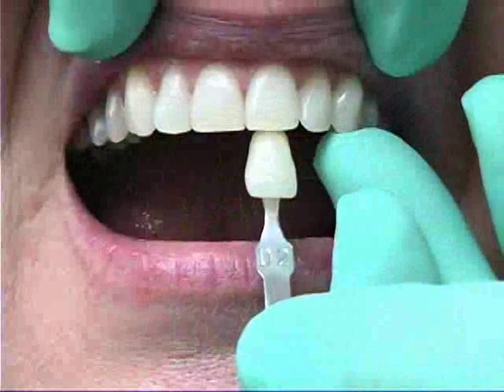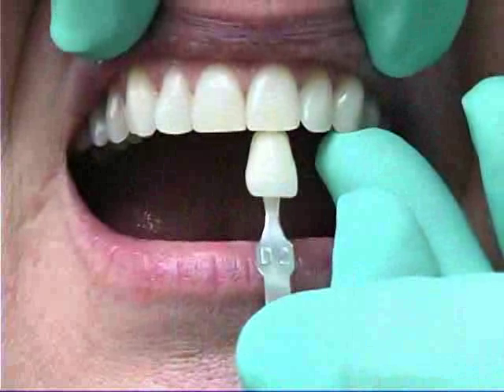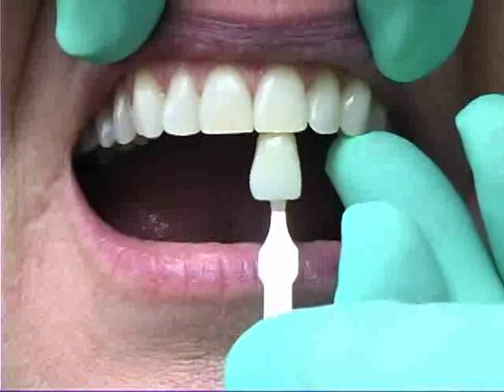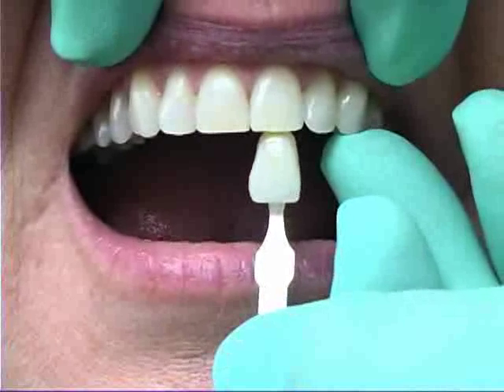When comparing a shade guide specimen and a natural tooth, it can be helpful to hold the guide sample below the natural tooth so the facial surface of the shade guide tooth and the natural tooth reflect light in the same manner.